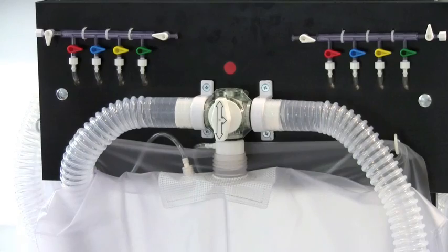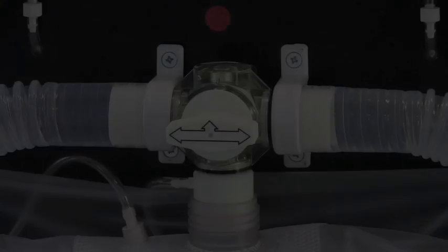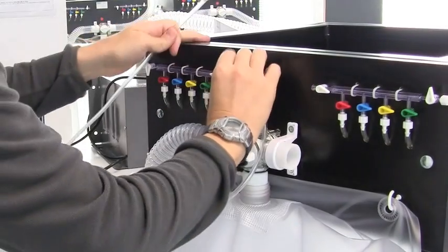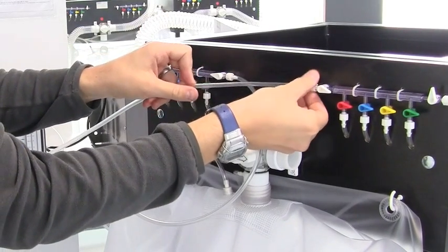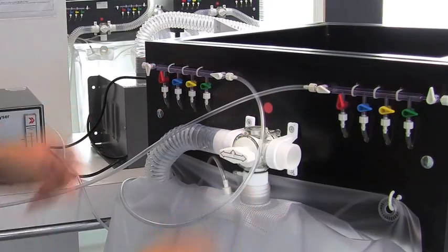Once you've finished your sample, shut the valve and then your bag is ready for analysis. Using the gas analyser, connect the tubing to the inside connectors on the Douglas bag rack, and then open the coloured valves which correspond to the colour of your bag, as shown by the dot above the valve for the Douglas bag.